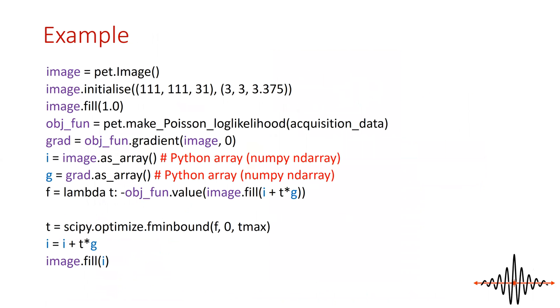And that's an example of how the code would look. As opposed to command line stuff, STIR originally was a lot of command line stuff. You now have Python and MATLAB interfaces to it. But SIRF went the other way around. We started off with Python and MATLAB interfaces and then said, well, okay, we now need to clean up our C++ interface. But the aim is to have all of those look exactly the same. So that's how this looks. There are examples on there.